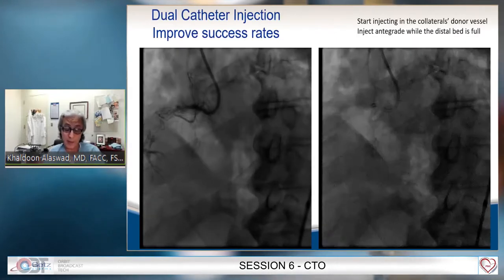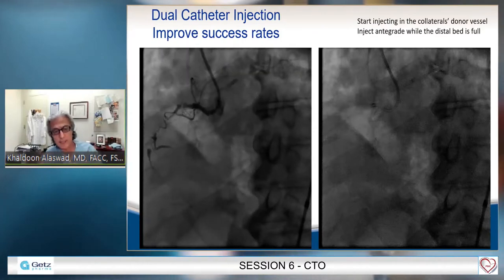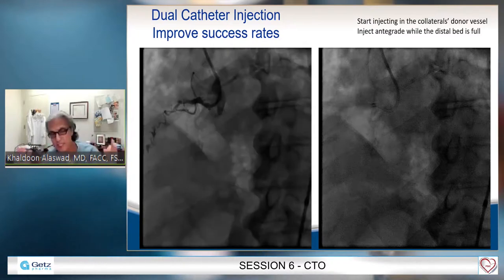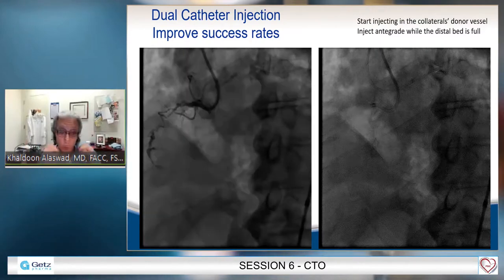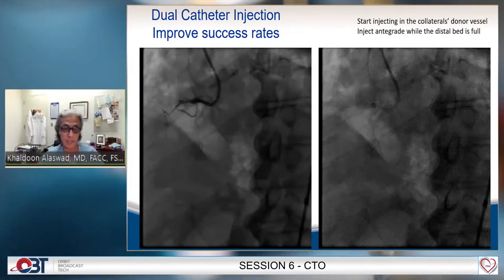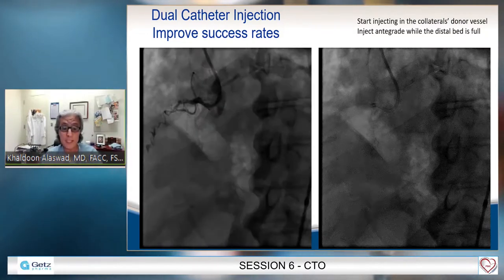So that's basically the angiogram, and you have to study the angiogram. As Dr. Aziz said, you cannot jump into the case. It's not a STEMI. This is a case that has to be not ad hoc. It has to be planned. You need to look at the angiogram over and over. If there are old angiograms, look at them.